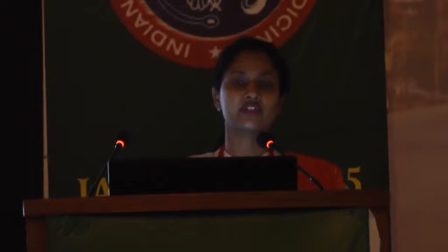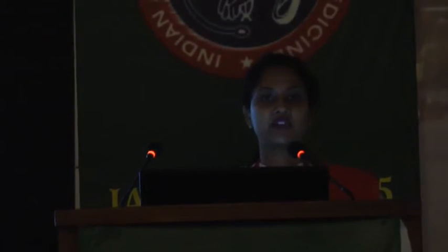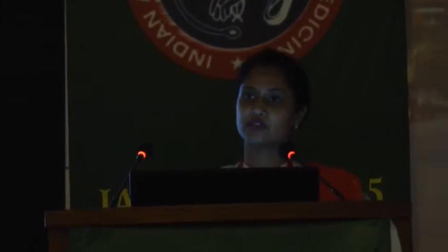And I've already talked about the perilymphatic distribution of nodules, very typically seen in sarcoidosis. However, a close differential would be lymphangitic spread of tumor. We would be aware of history of tumor in such a patient, so not difficult. And there can be randomly scattered nodules. These are the miliary nodules. Common examples: miliary tuberculosis, viral pneumonias, miliary metastasis, and very early stage of Langerhans cell histiocytosis.